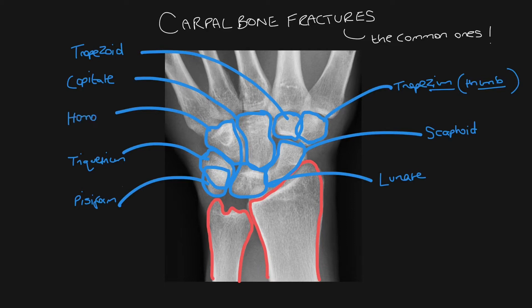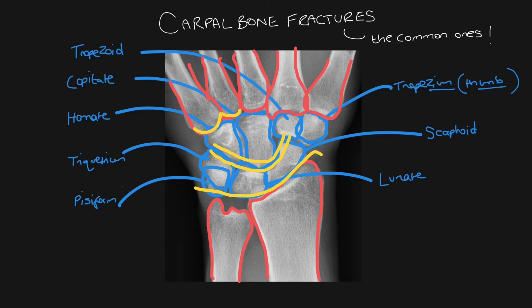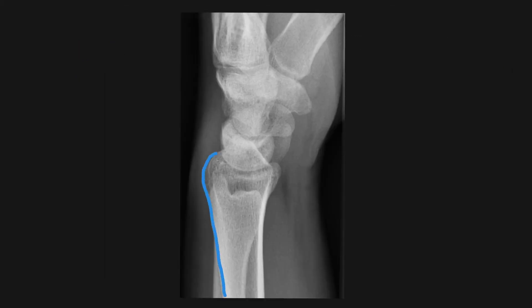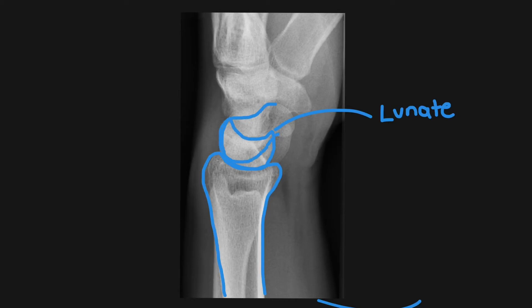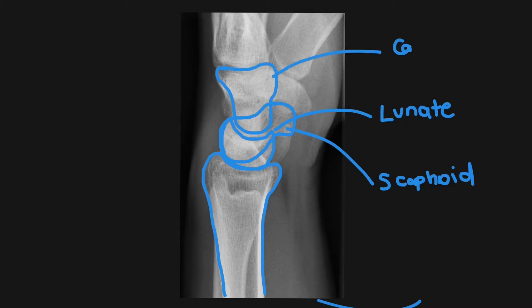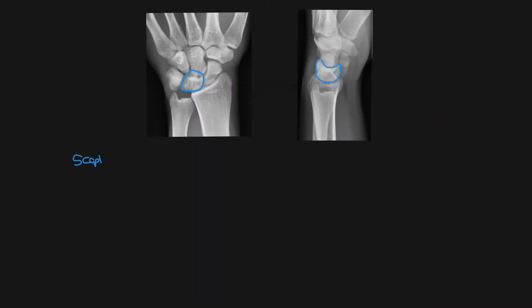Once you've done that, you want to look at the alignment of the carpal bones, so you draw the three carpal arcs and look again at the proximal metacarpals. On a lateral film you want to look at the distal radius and make sure it lines up nicely with the lunate, which is this moon-shaped bone. You can also see the scaphoid on a lateral, and you want to see the capitate sitting nicely in the lunate.